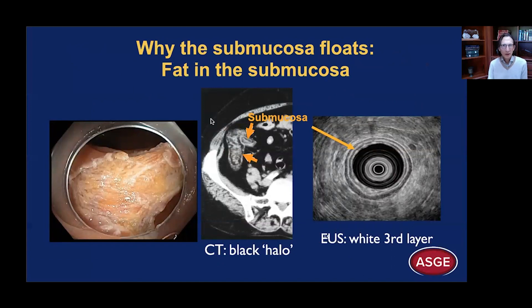So why do we get this floating effect? It is the antigravity effect of water, but the submucosa also contains a large amount of fat. Radiologists see that in the submucosa — they call it the black halo sign. On EUS, that third layer, the submucosa, contains fat, and that is why it is bright and echogenic. You can see here the yellowish fat tissue in the submucosa after performing EMR.